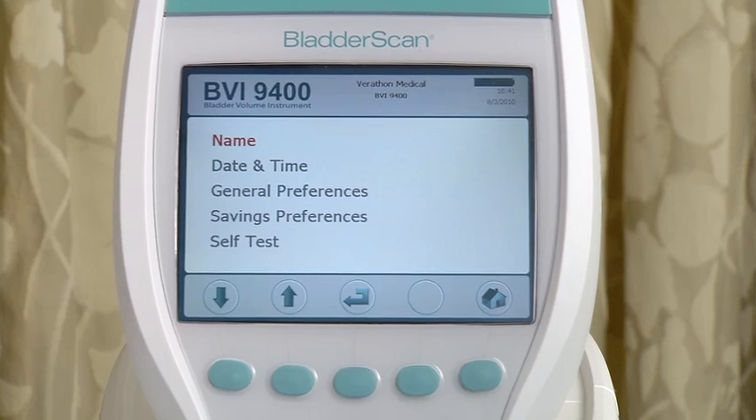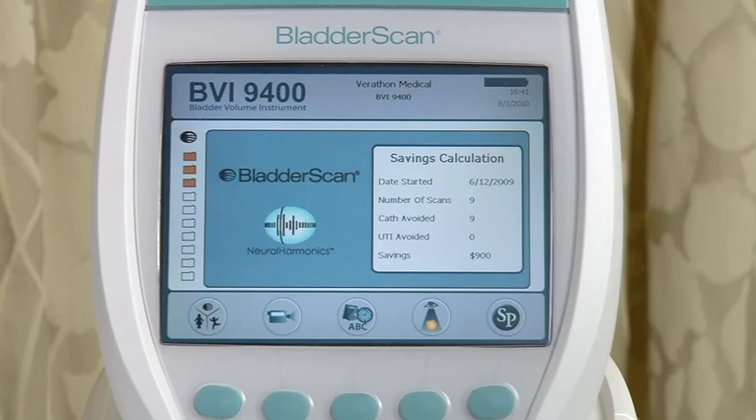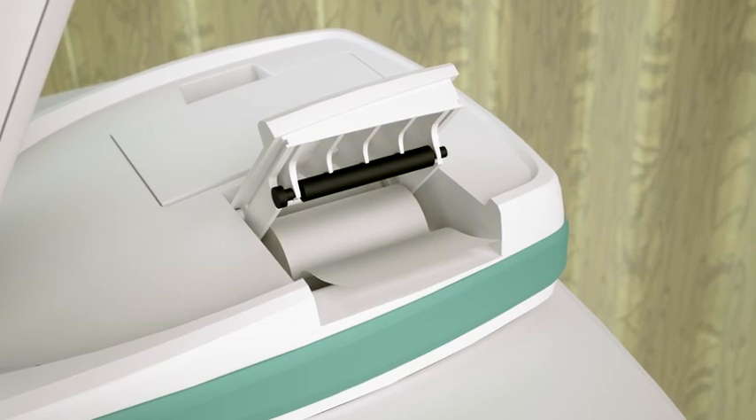It comes with a manual, and I recommend you review it before you use the device. Before using the Bladder Scan, personalize the instrument with the name of your practice and the correct time and date, as this information will be shown on all printouts. Check to make sure the battery is charged and there is enough paper in the printer before you start to scan a patient.